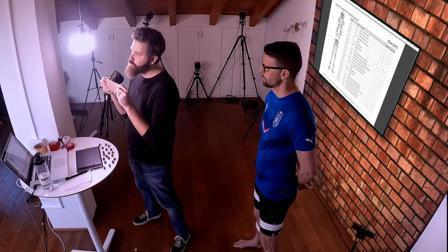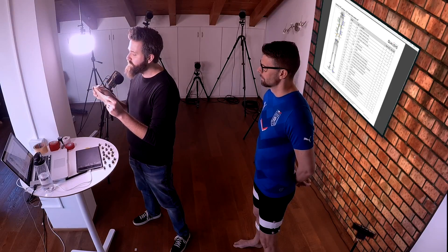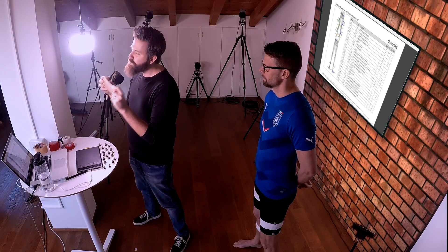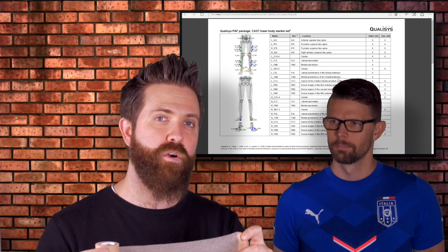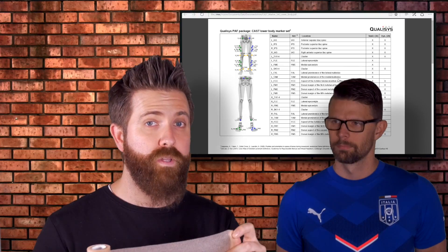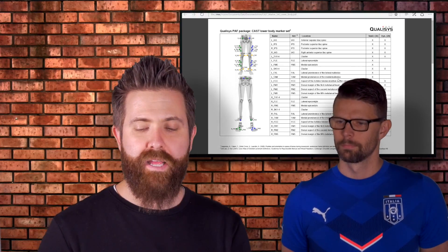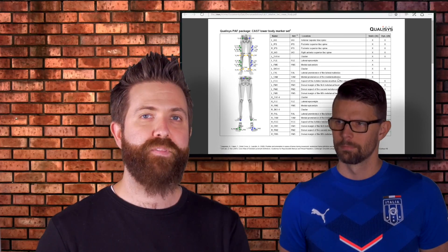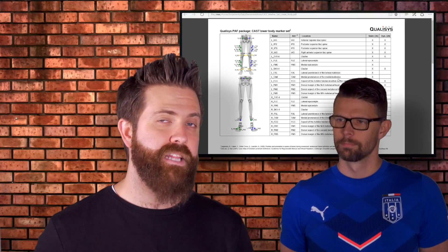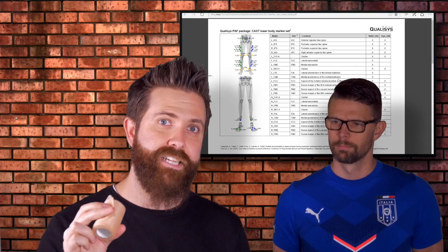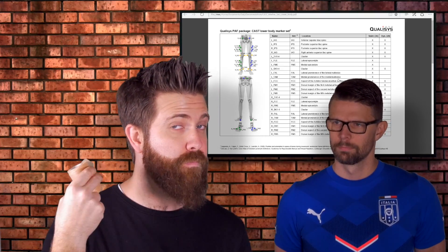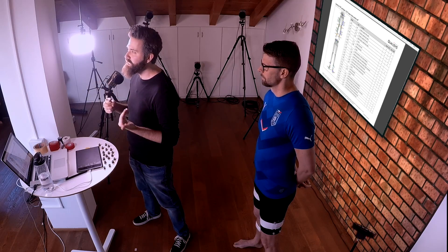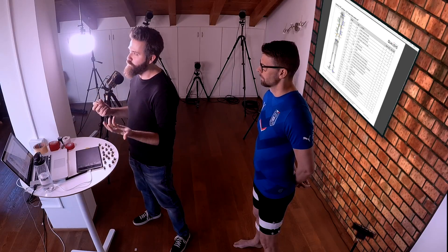One thing that I found really helpful is to use this fake skin, which can be very helpful if your static markers at the knee and ankle are only going to be on for the static trial. Since we're going to use this data also for a conventional gait model, I'm going to leave the lateral markers on, so I'm not going to use this today. But this might actually be very helpful in a clinical practice, as then you're not having to place markers directly on the skin, especially at the knee, and you avoid some discomfort for your patient.